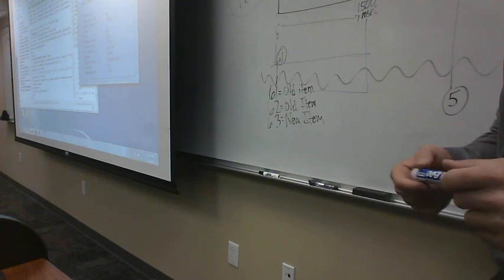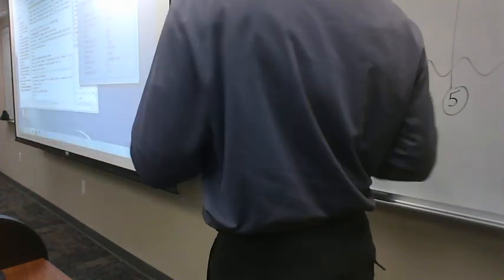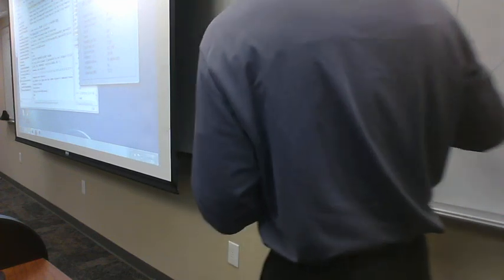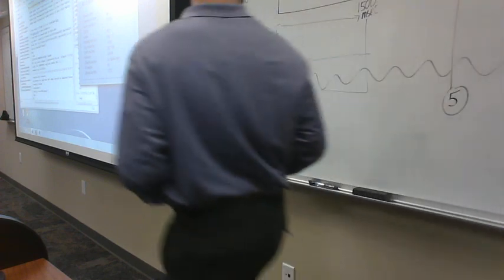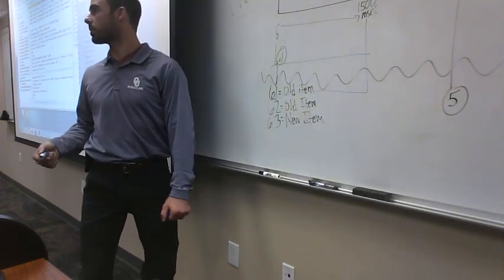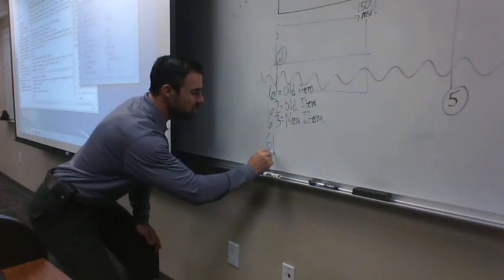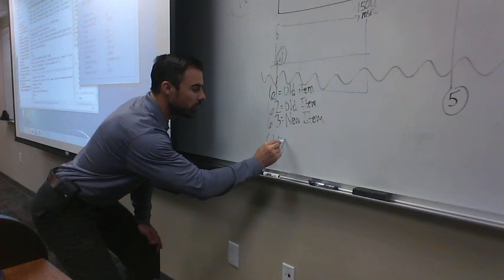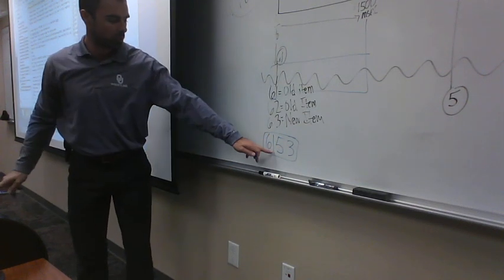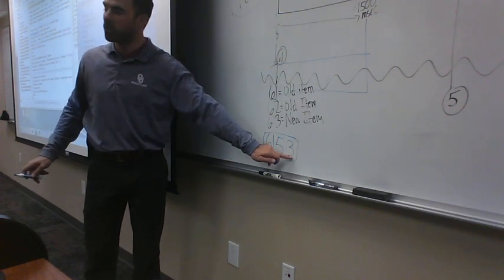Okay? And the reason we're deleting it is because, as a favor to you, what I did beforehand was I took these codes and I made sure that we don't forget what this information is, because I went and worked with the data 8 years ago, and I made it so that this code now reads as 6153, which means it's an old item, their item memory was a 5, and their source memory was a 3.